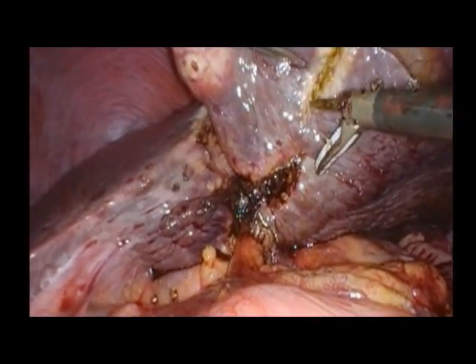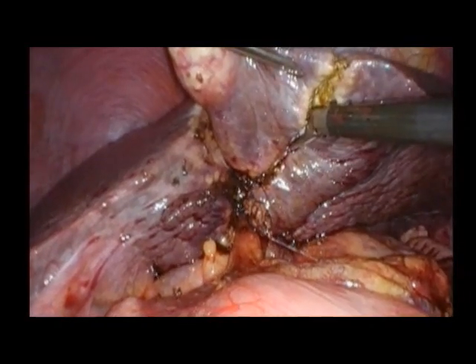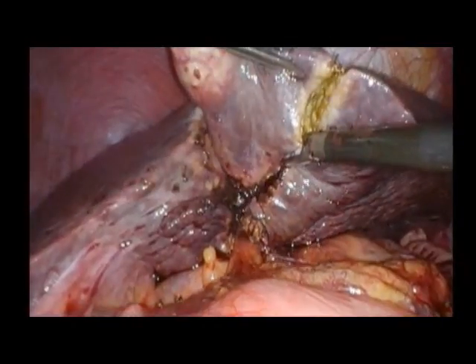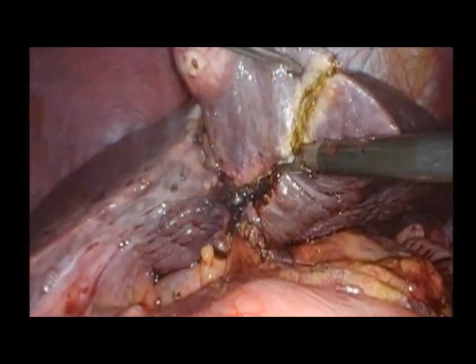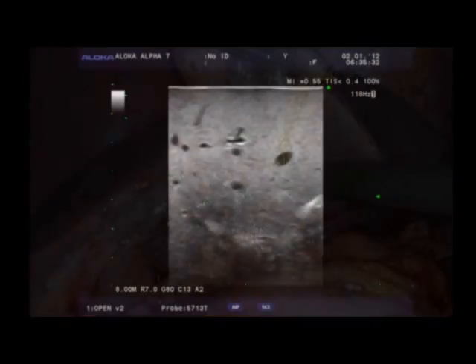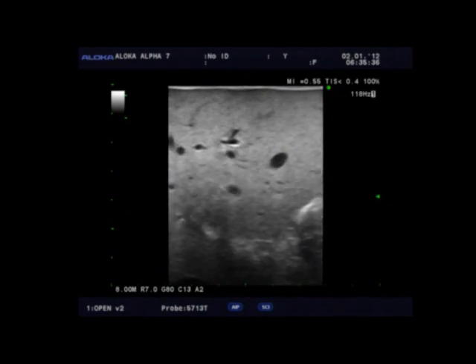Here is another example of a small hepatocellular carcinoma that is resected with a coagulation device from the tip of segment 3 of the liver. Intraoperative ultrasound is vital to allow for navigation and assuring accurate margins.